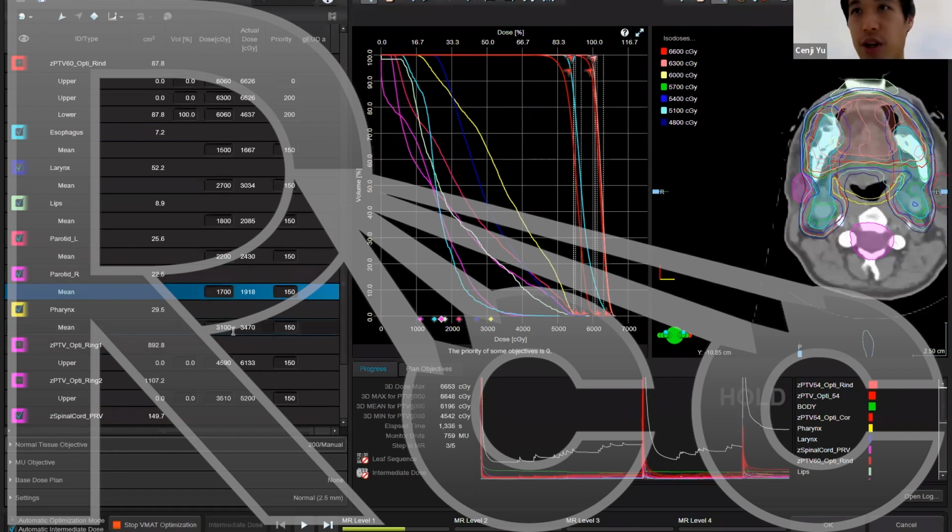I'm not sure if you have more time, but also what are the bases to decide the priority values of the NTO? Yep, so this is just trial and error, and it works. I urge you to start with the process that we've developed. If you want to adjust it, fine tune it based on the principles that we teach, that's great.